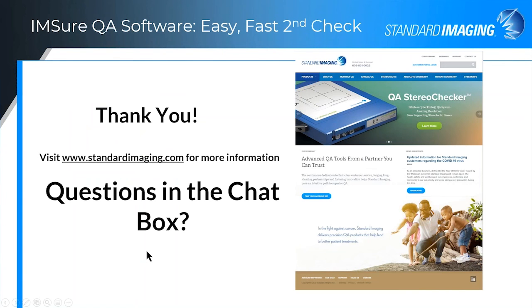And so IMSure, it's very easy to use. It's fast second check software, and you can get up and going with IMSure very quickly and easily in your clinic.